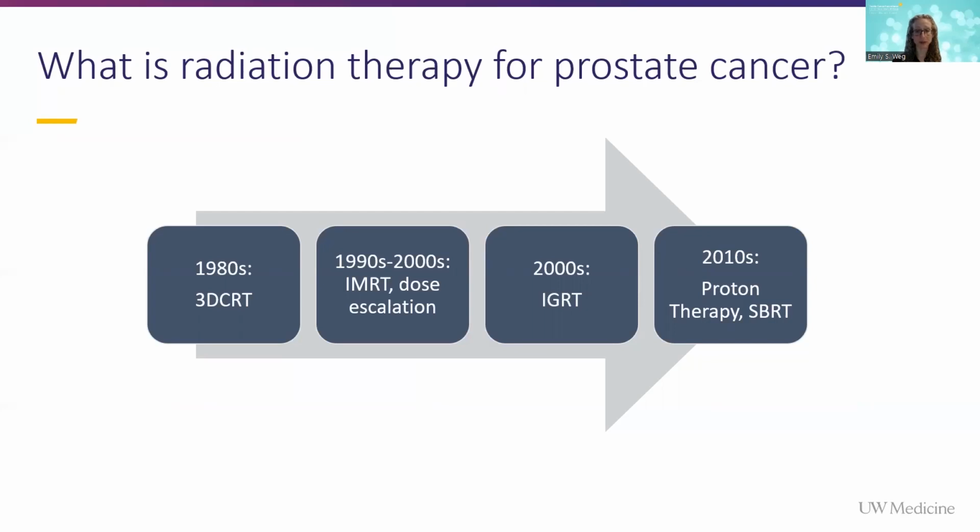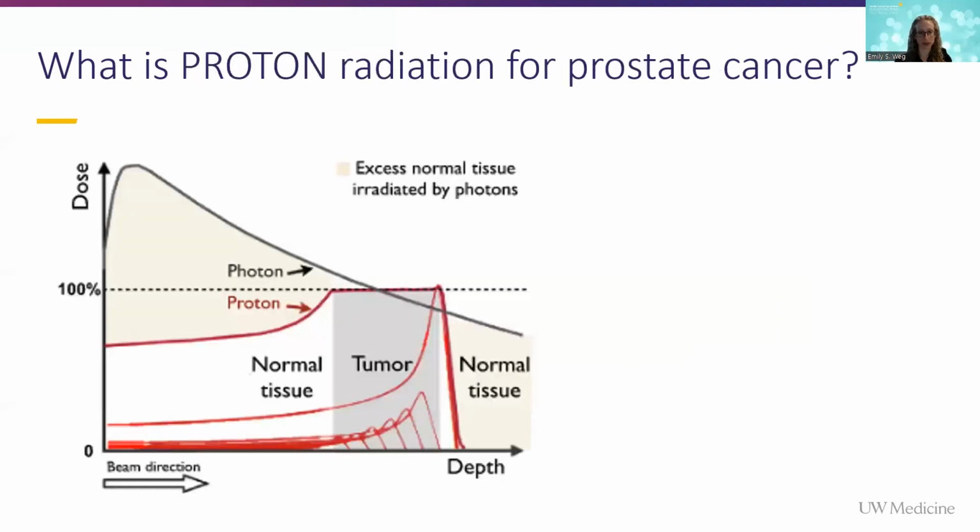This diagram is purely meant to introduce what I like to call the alphabet soup of radiation therapy. So these words like IMRT, and IGRT and SBRT are where patients who are making the extra effort to self-educate may start finding themselves lost in the weeds a little bit. So in broad strokes, what these represent are evolving techniques that have refined our ability to deliver higher, more ablative doses to the tumor, while enabling us to minimize the dose going to healthy tissue.